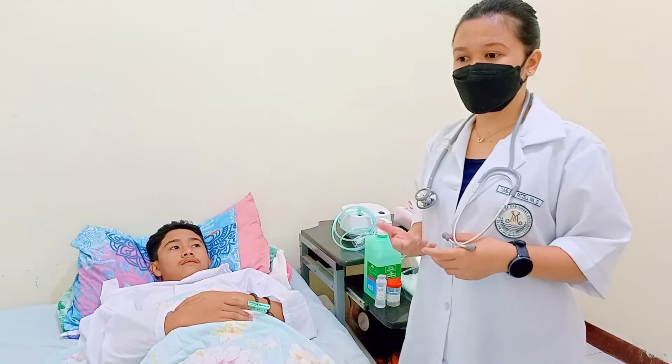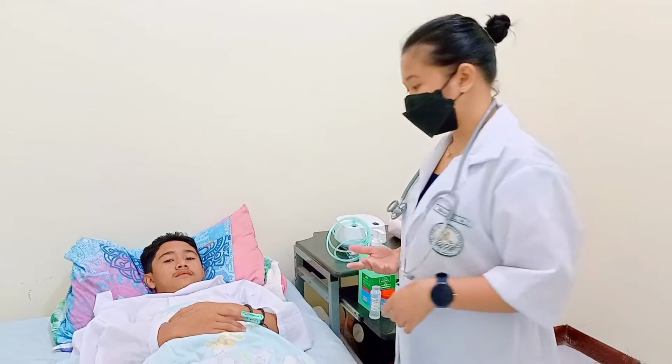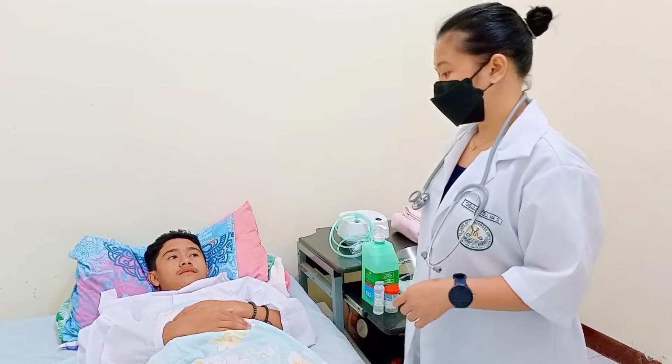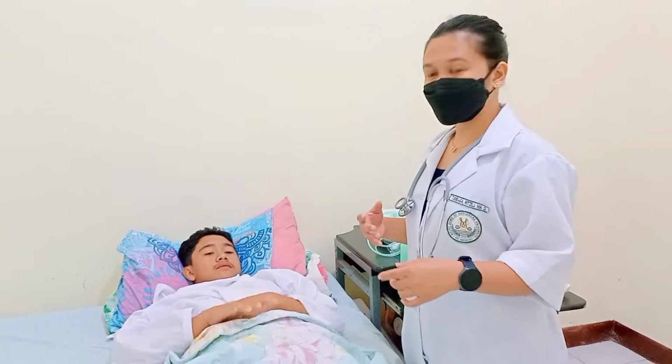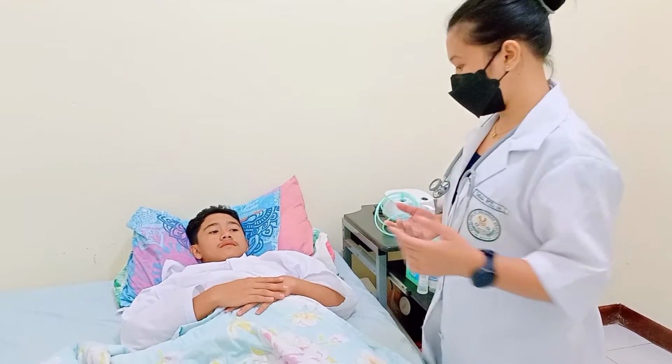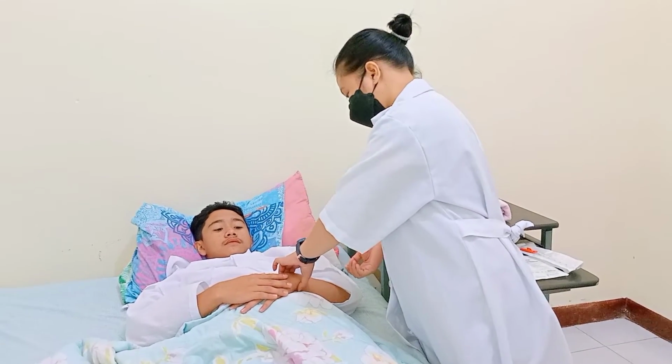Suctioning should be performed only when necessary to prevent unnecessary tissue trauma. And also inspect the fingernails and skin color in the upper and lower extremities.